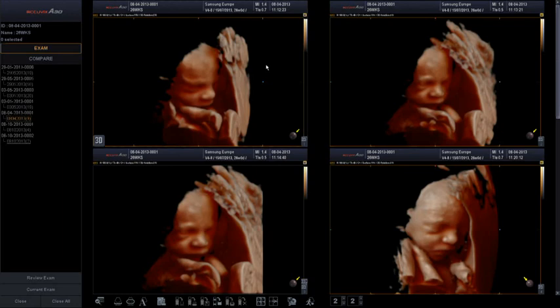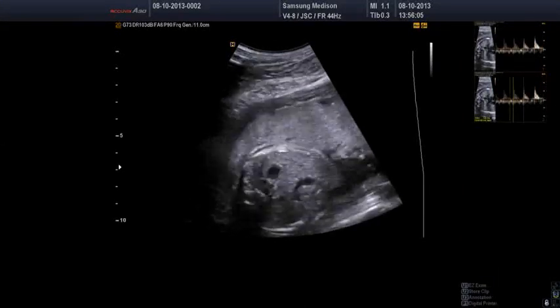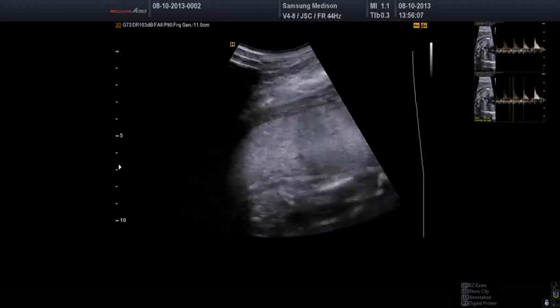Yes, I can hear you, Rabbi. Okay. So, good afternoon. Hi. Are you ready? Images. You do now 3D of the face. Your topic is the left heart.